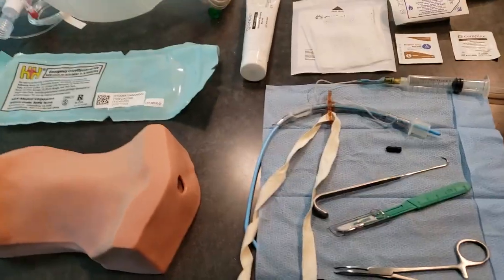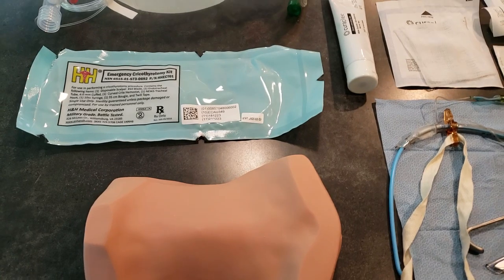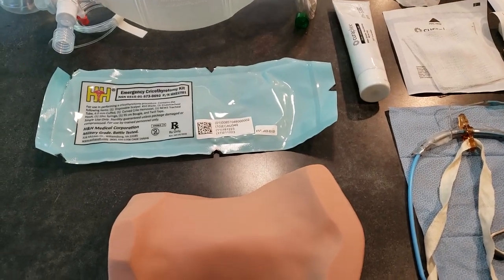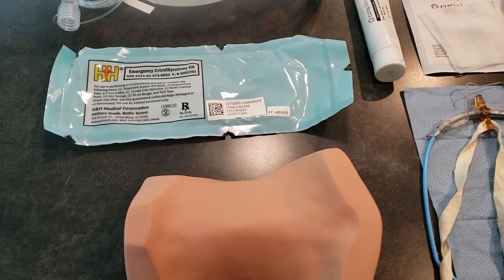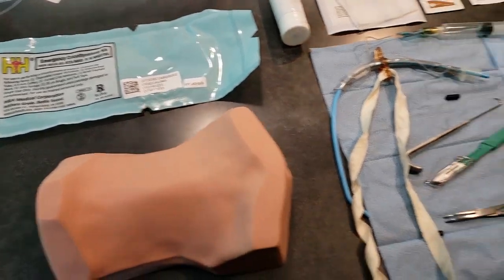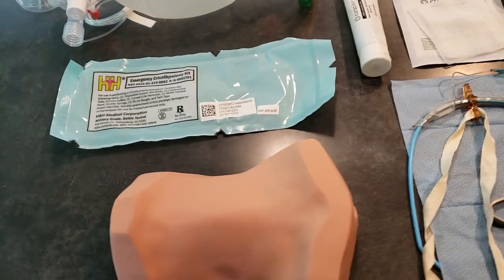Welcome to my kitchen. Today we're going to be talking about your emergency cricothyroidomy. We're going to be using the H&H emergency cricothyroidomy kit, and first we're going to talk about when you would need to do this.